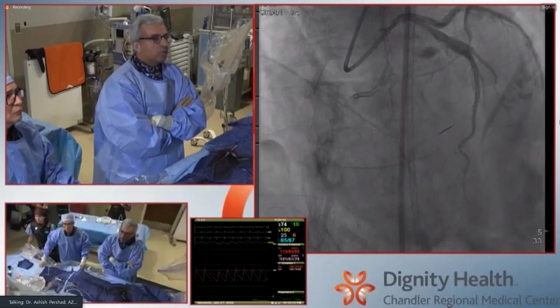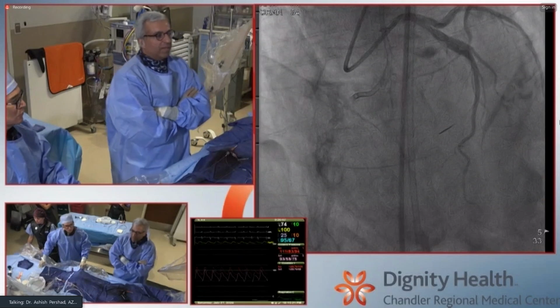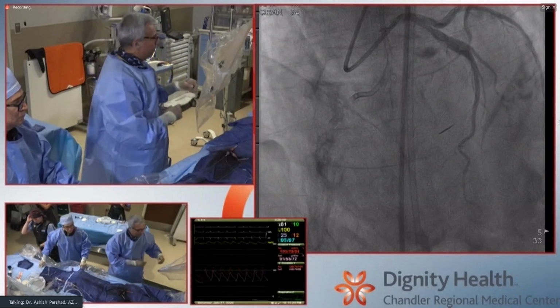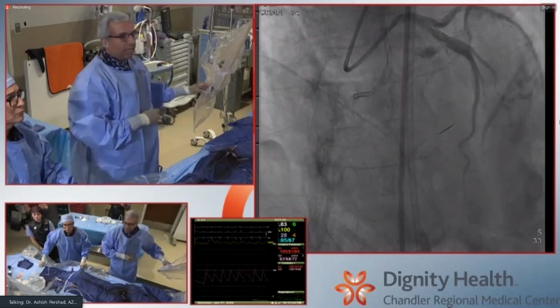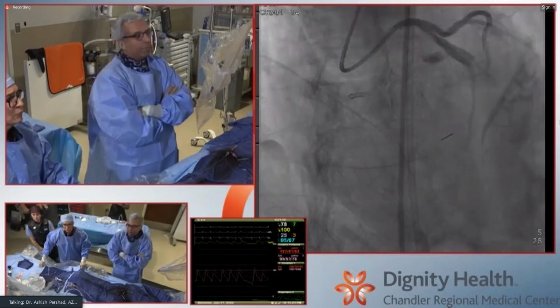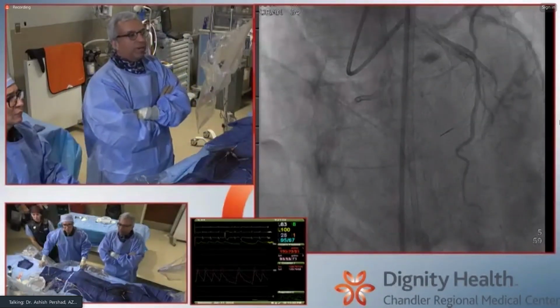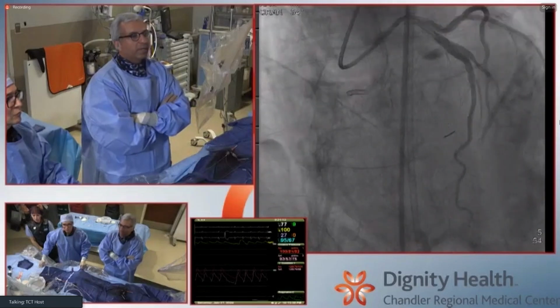So I think I don't disagree. This is going to be, just from the virtue of the large amount of calcium and the vessel being fairly tortuous, requiring bilateral knuckles. We may get lucky antegrade, but I doubt that that's going to happen. And so probably will require bilateral knuckles and then end up with the retrograde reverse CART as the strategy.